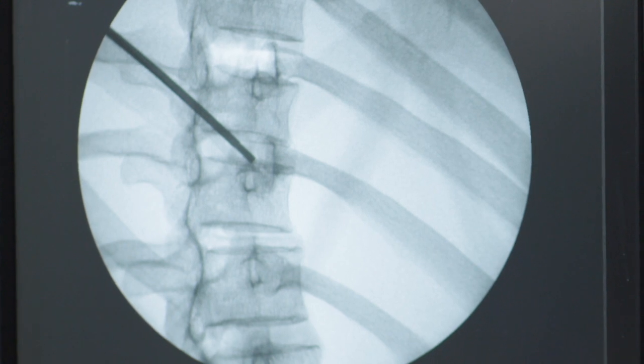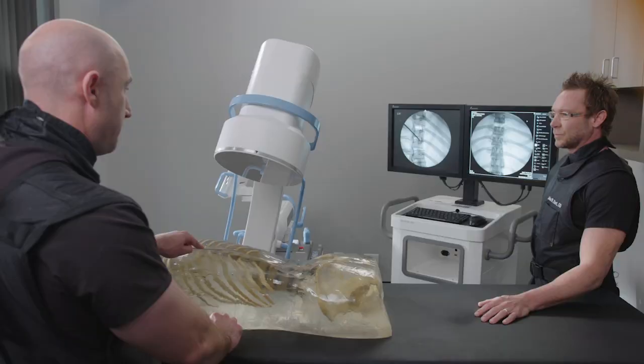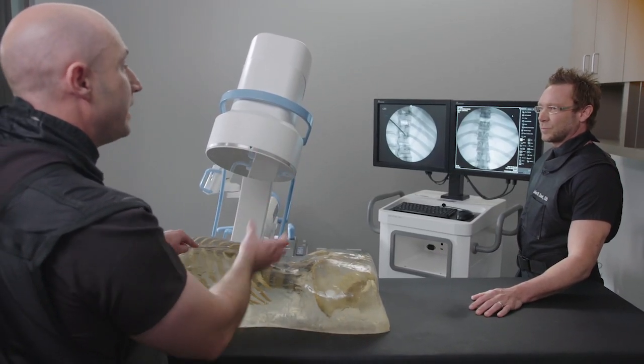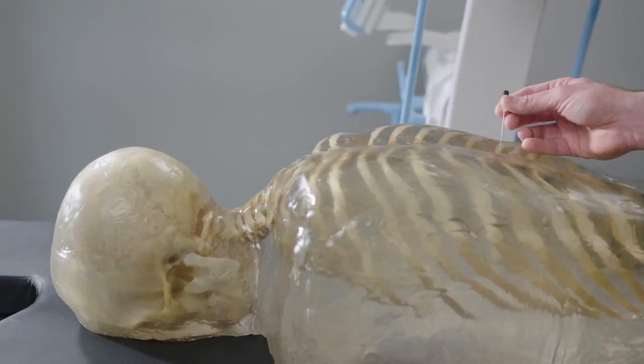So in the thoracic spine, the most common type of transforaminal procedure is a retrodiscal transforaminal. And again, this is a challenging setup. You have to tilt and oblique to get the end plates aligned of your vertebrae, and you have to find that very small gap.